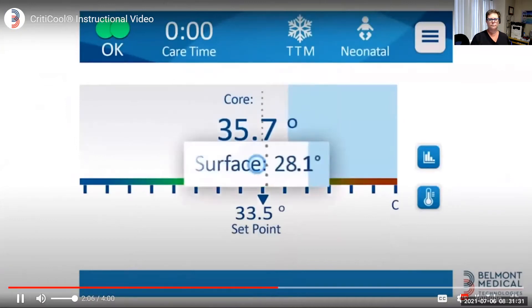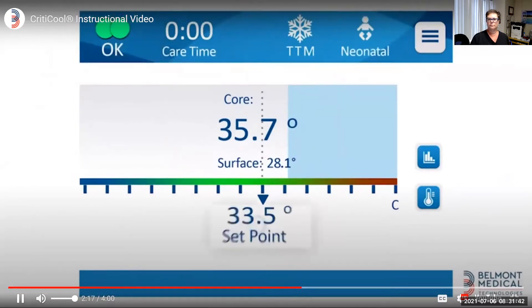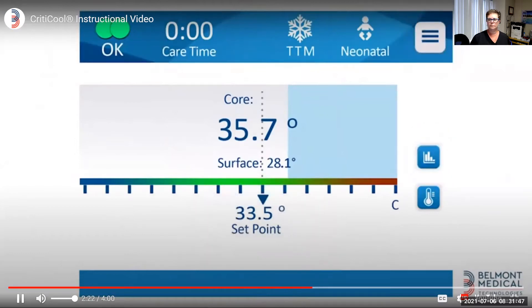Core temperature. Surface temperature. Duration of treatment. The selected mode. Adult or neonatal mode. Circulation icon shows that water is flowing through the wrap. Set point temperature. Main menu icon. Temperature graph icon. Set point selection icon.